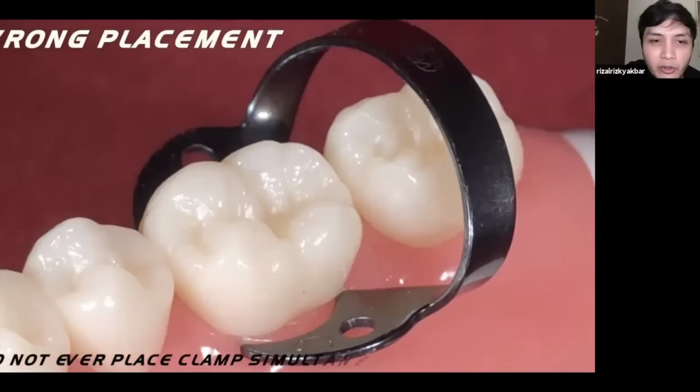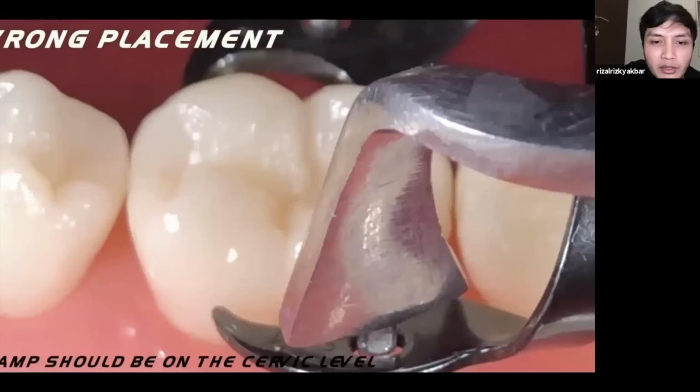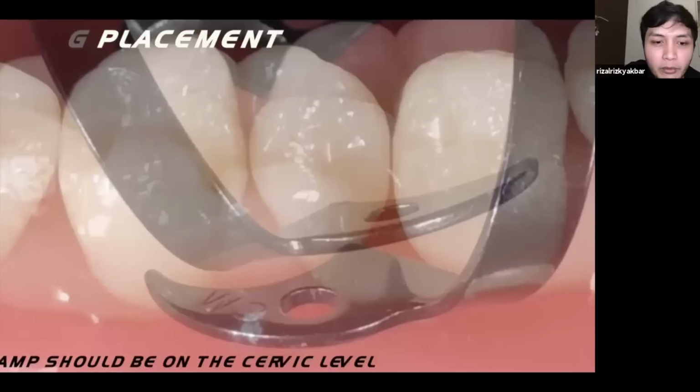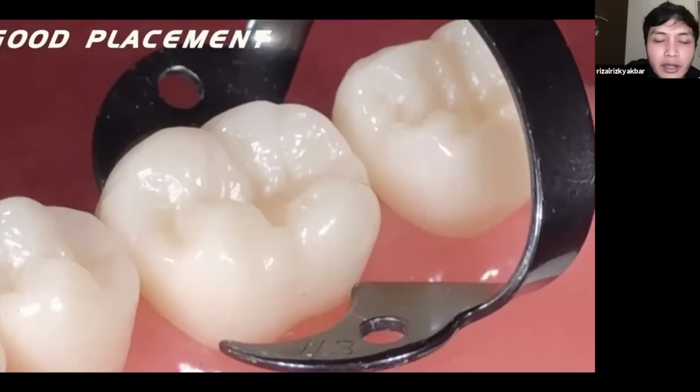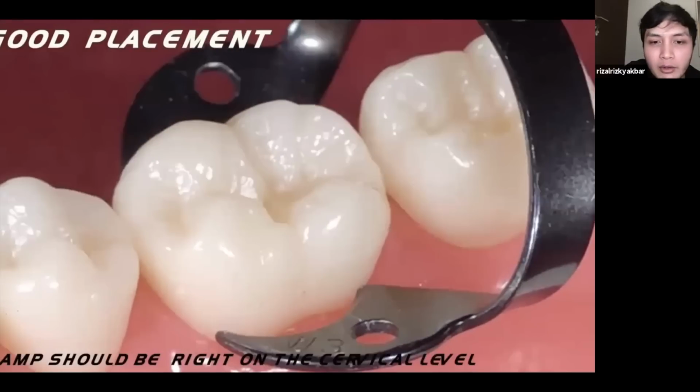This is the wrong placement of clamp, because the clamp should be on the cervical level. You have to follow the curvature of the tooth, and then you have to place it right on the cervical level.